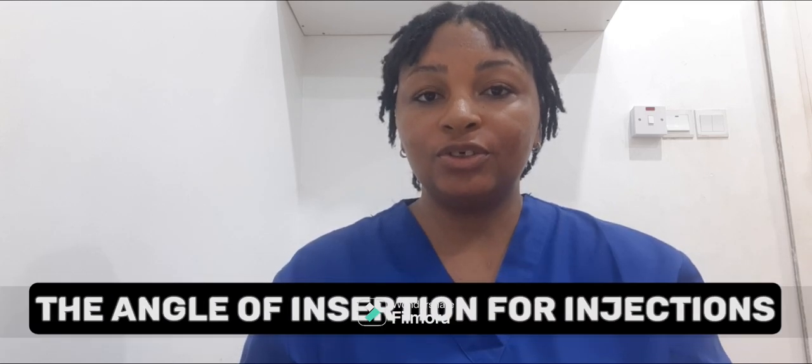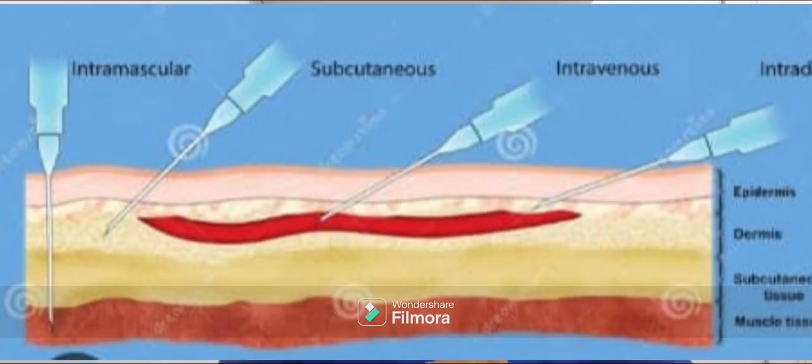So in today's video I'm going to be showing you the angle of insertion for injection. There are intramuscular injections, subcutaneous injections, intravenous injections, and intradermal injections. So I'm going to be starting with the intramuscular injection. I'm going to try as much as possible to show some pictures as a form of illustration on the screen so you can really understand what I am talking about.